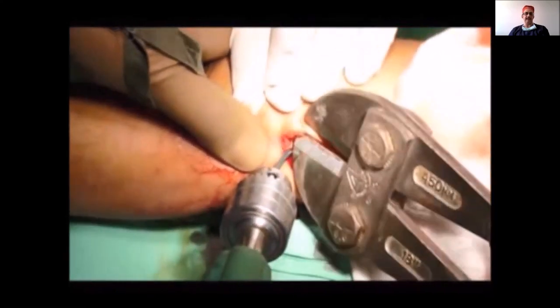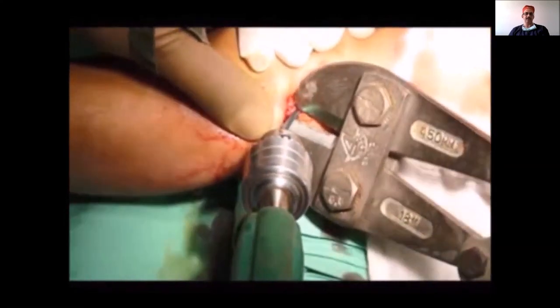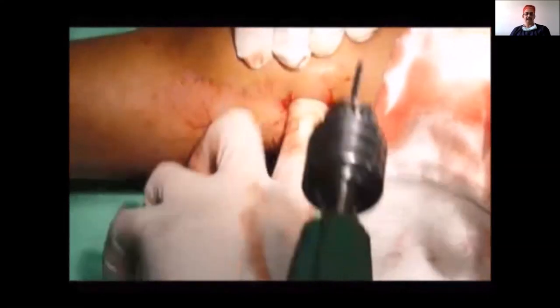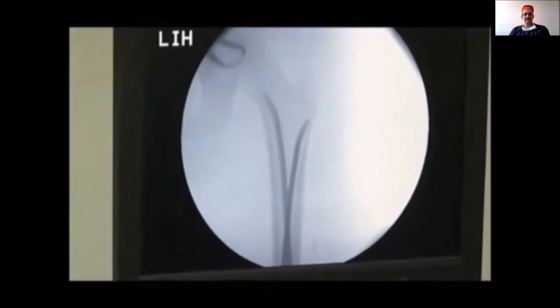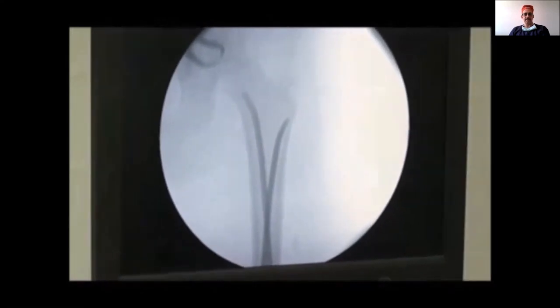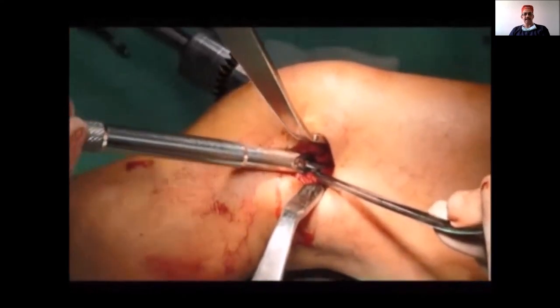It is important to do this step correctly — this is not a K-wire that needs to be bent at right angles and left outside, as that causes irritation of ligaments and synovium leading to a stiff knee. Make sure it goes under the muscle. Using the seating tool, you can see the nail is now along the cortex at the proximal seating point with the spindle at the fracture. The seating tab has a bevel; turn it around — it has a small hollow — and tap it so it reaches the cortex.